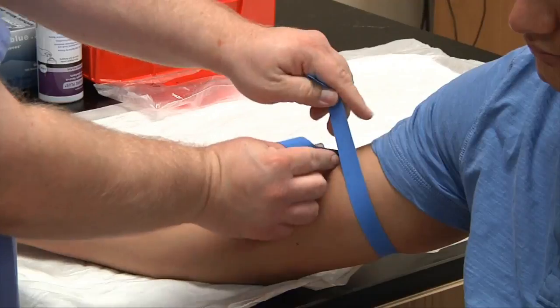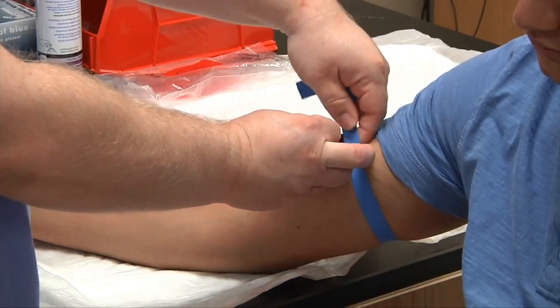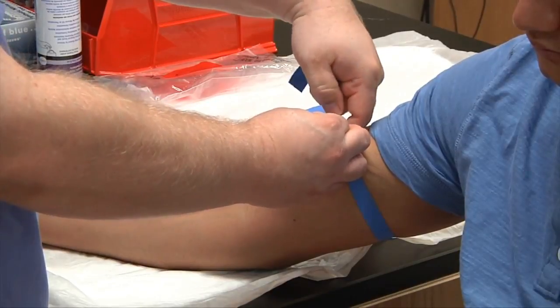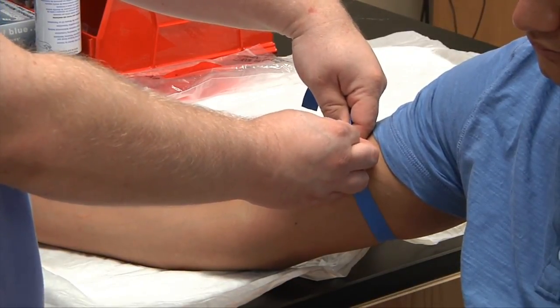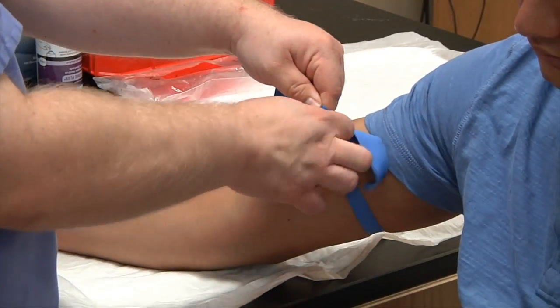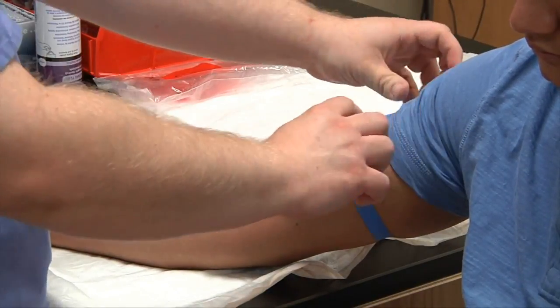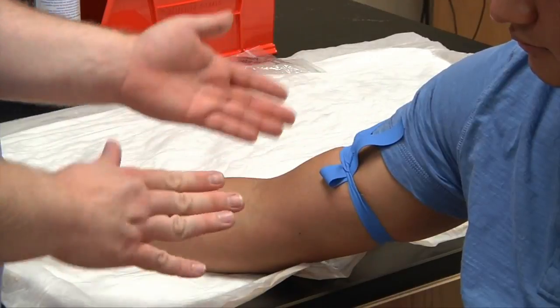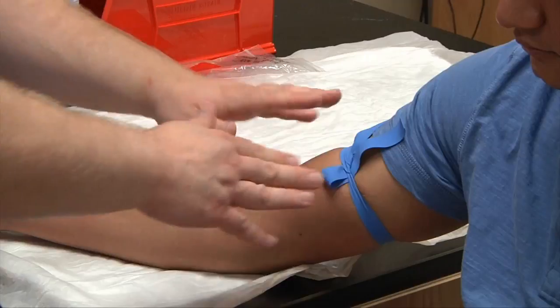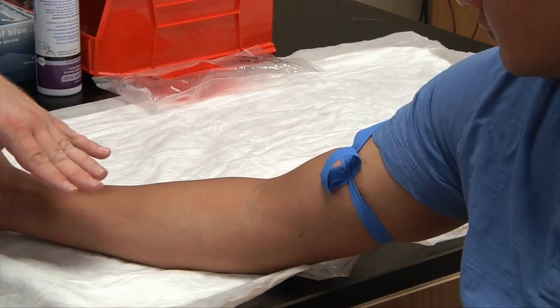I have my tourniquet around the patient's arm. With my non-dominant hand, I'm going to position the strap on the backside and give it a pull. Then I place my pointer finger of my non-dominant hand underneath the tourniquet, pull with my dominant hand, and tuck under — leaving a little tab to release the tourniquet. Remember, we always want bunny ears up, not frog legs down. The tourniquet is in place, nice and smooth and flush. We just need a little bit of constriction to get the veins to pop up.